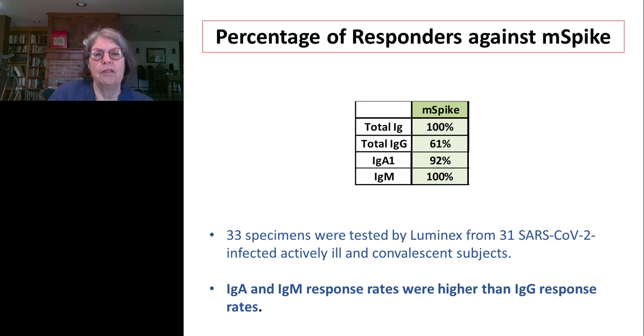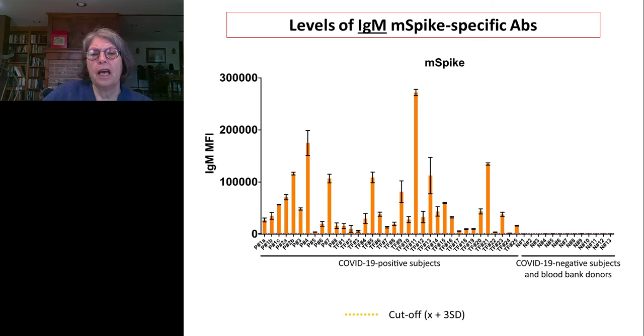For example, if you use an anti-IgM secondary antibody, you can look at all of the patients, as we did here, and we can say that the patient with the highest spike had, relative to other patients, the most robust response in terms of IgM. But the level that you read probably is quantitatively different than you would get with an antibody against, say, IgG1.